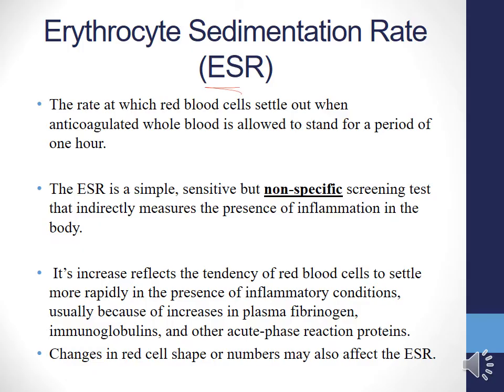So this is the basics for this test, the ESR. The ESR, by definition, is the rate at which red blood cells settle out or sediment when anticoagulated whole blood is allowed to stand for a period of 1 hour. And it's very important to know that the ESR measures the rate of RBC sedimentation in 1 hour. This test is very simple, it's very sensitive, but it's non-specific. It is used as a screening test to assess for the presence of inflammation in a certain patient.